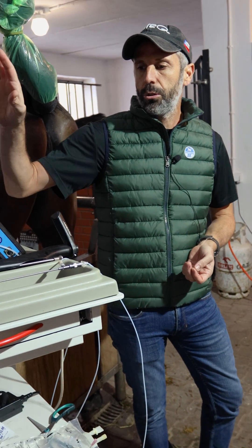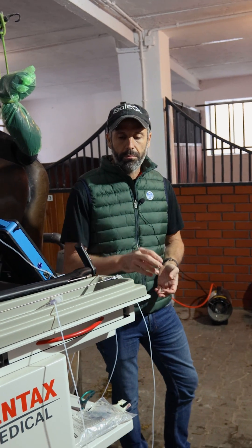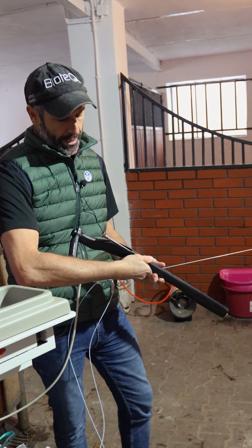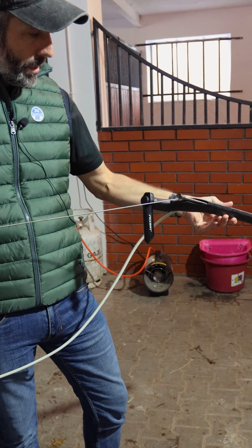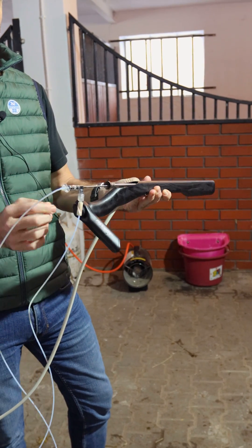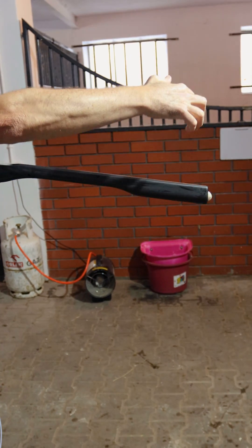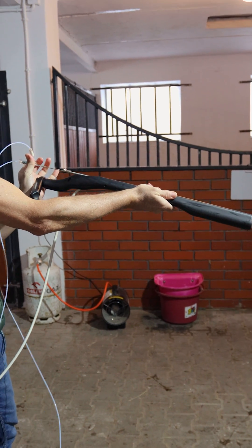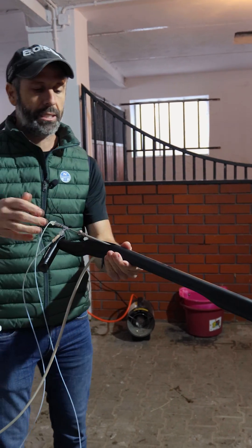They work with Minitube — we also have this pump here in Spain and we have an agreement with them. Any needle would work for the guide of the Draminski. Here we have the guide — the needle goes in here and this is quite stable, so you just can work. It's very handy because it has the handle, so you just grab the ovary with one hand. At the same time you can push the probe and drive the needle, while you hold the probe in place. This is quite a good system and the monoblock has the same.